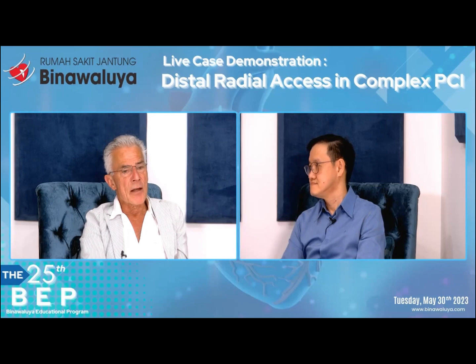If the patient is heavily anticoagulated, if the patient is hypertensive, if the patient is obese, keep it within safe limits, and that's a removal time somewhere between 1 and 2 hours. But in this situation, after 1 hour, it looks really beautiful. And that's also a general recommendation.